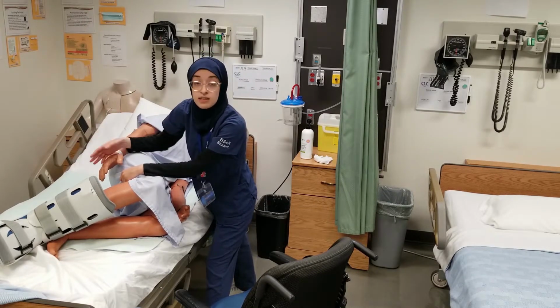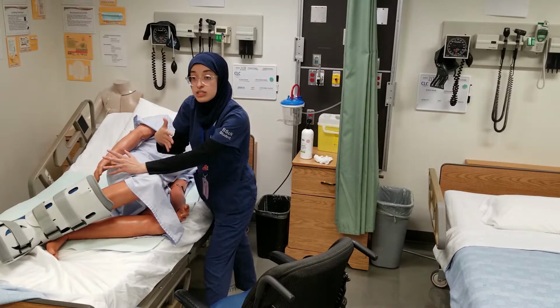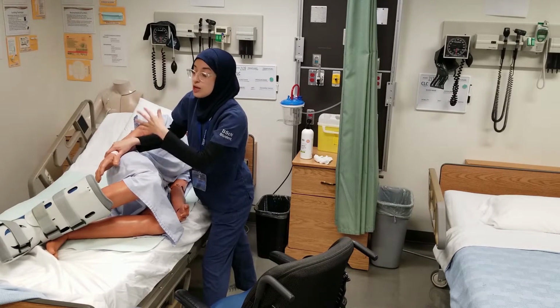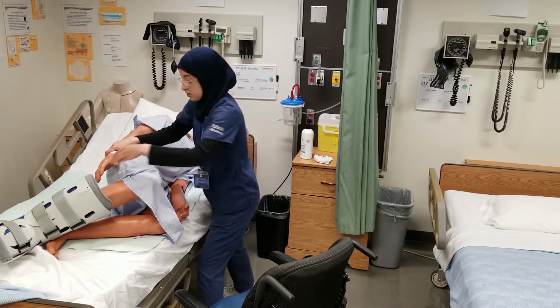So we can try and ask the patient, if they do have control of their legs, to maybe bend or to dodge the wheelchair, but we want to take that into consideration because the patient may not always be able to do that. Bear in mind that this is a mannequin, so it's very stiff and I cannot ask that, so you may witness that I struggle a bit as I'm trying to move the patient up. That typically wouldn't happen with a real person that I'm transferring.